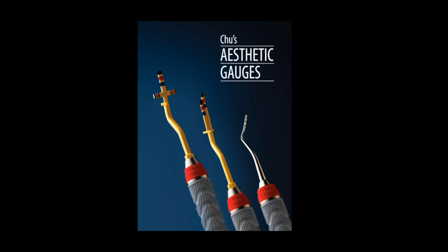They've got 3 different gauges. The first one, it looks like a cross, is for soft tissue recontouring. The second one is for actually bony recontouring, particularly open flat bony recontouring, where you can see where your tissue height is, and the offset gives you a 3 millimeter biologic width setting, so you know where you are as you're doing your bony recontouring. You know when you're at the 3 millimeters biologic width that you need.